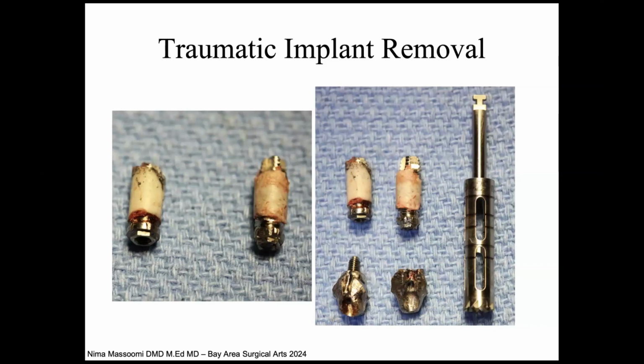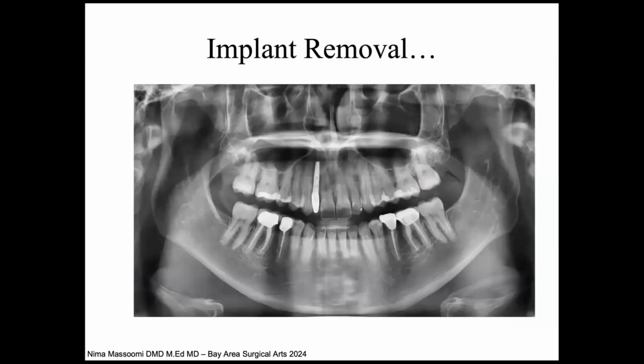They have to be very sharp because once they get dull, they generate so much heat and then they destroy even more bone after you've taken the implants out. So I go into that case for the physician with the mindset that, hey, I may have to use a trephine burr. So that's why I was like, hey, lady, I'm sorry, I can't touch you until you go get orthodontics to move the teeth apart. And her jaw literally dropped to the floor, right?